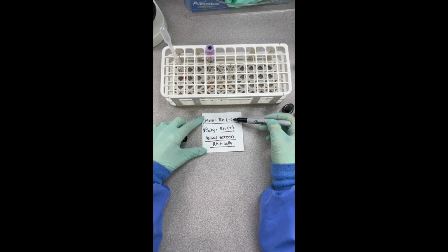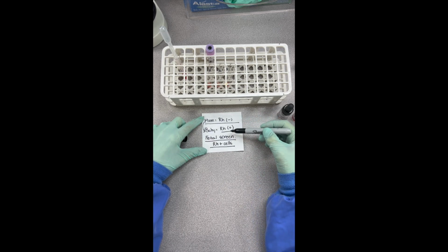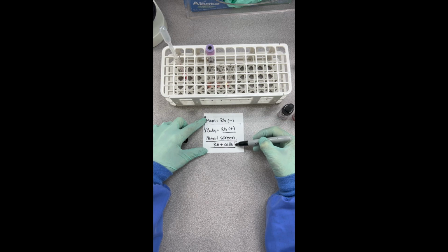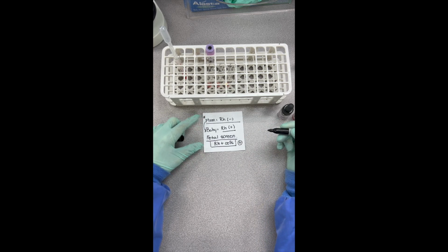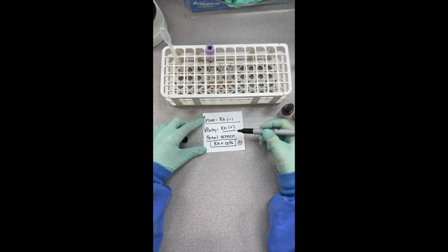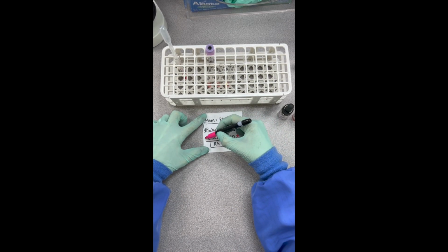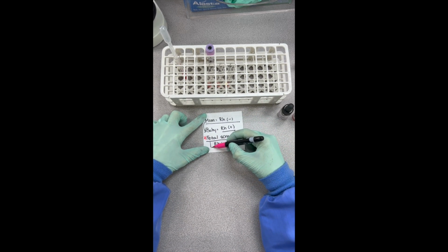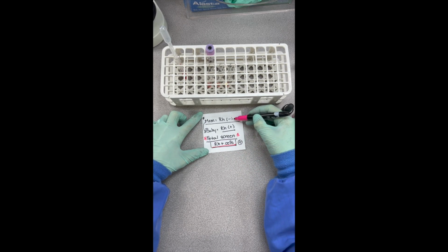And that's because we're only doing this on Rh negative individuals, and for a fetal screen, what we're detecting are Rh positive cells. And I'm going to designate those like this. So I'll make a couple little pictures that we'll talk about as we go through this. So remember, this is very important, a fetal screen detects Rh positive cells. And you're only going to do this on an Rh negative mom who's had an Rh positive baby.